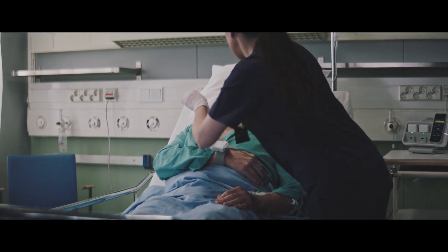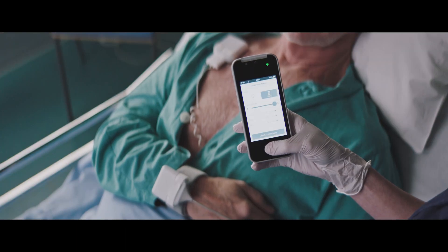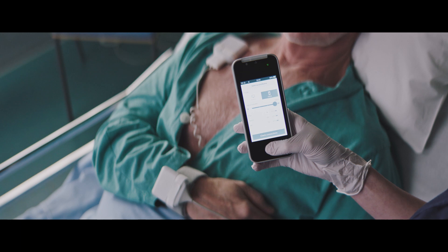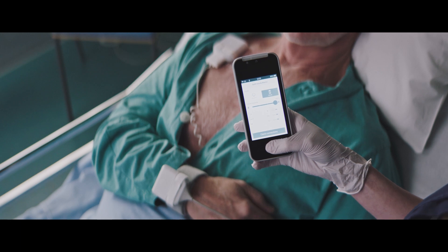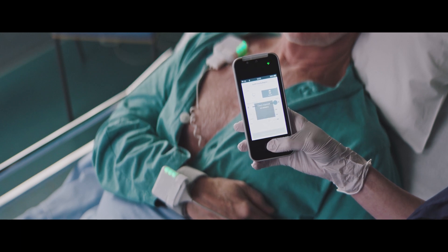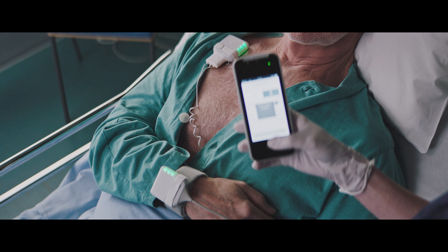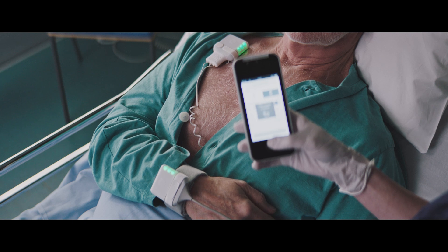At any point in time, the nurse is able to confirm the sensor's connection to a specific patient monitor by initiating a connections check from the patient monitor's user interface.